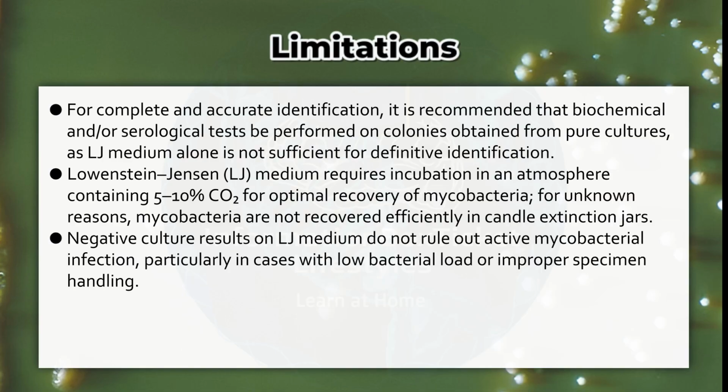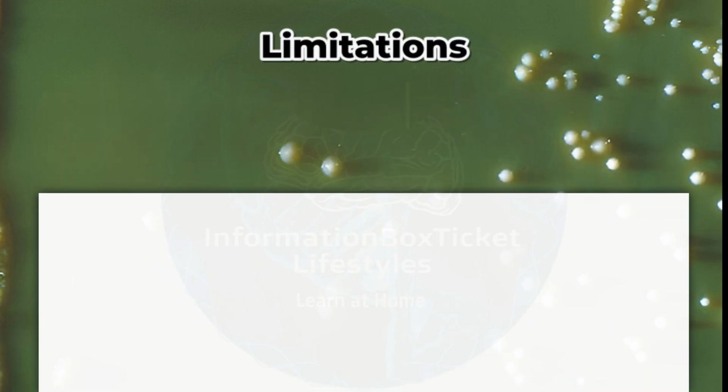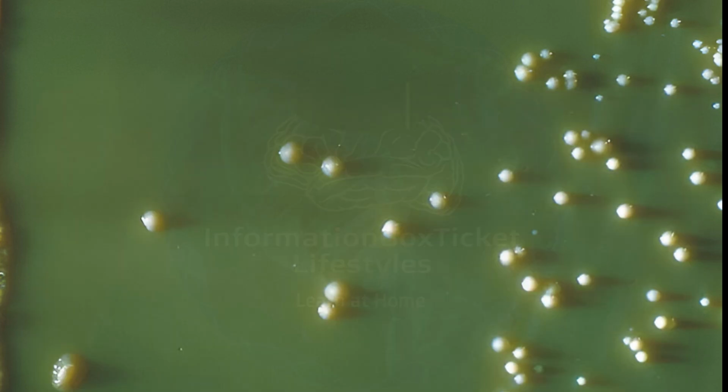Negative culture results on LJ medium do not rule out active mycobacterial infection, particularly in cases with low bacterial load or improper specimen handling. Due to nutritional variation, some mycobacterial strains may grow poorly or fail to grow on LJ medium, making additional tests necessary for confirmation of Mycobacterium species.